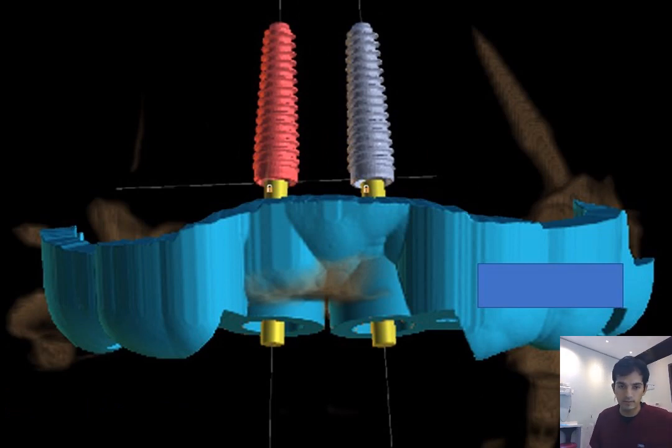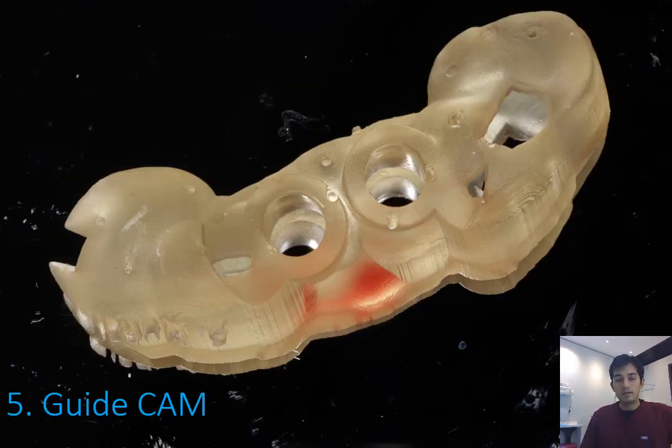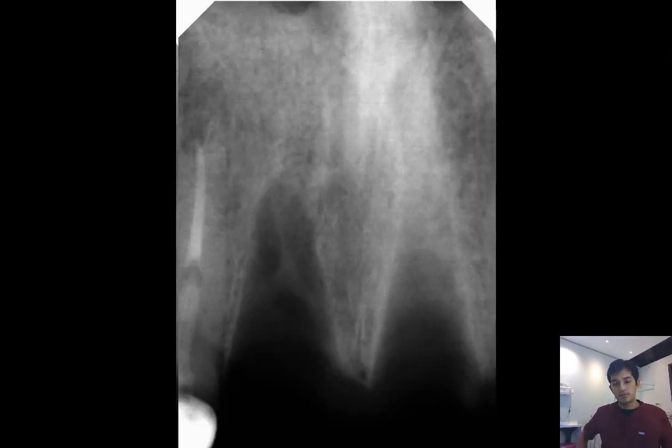So this was our final design of the guide, based around the prosthetically planned implant positions. This was designed to extend to 2 to 3 teeth on either side of the edentulous gap. A picture of the guide, a close-up here. This picture was taken after the surgery, hence the reason why there's blood on the guide. But just to show you what the guide looks like in its final form. And we go straight into the surgery now.